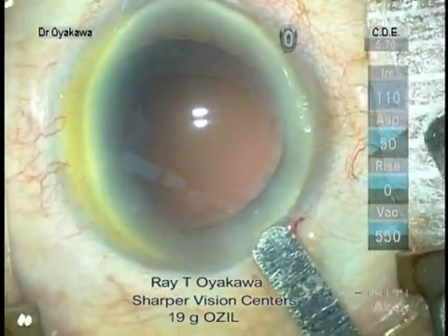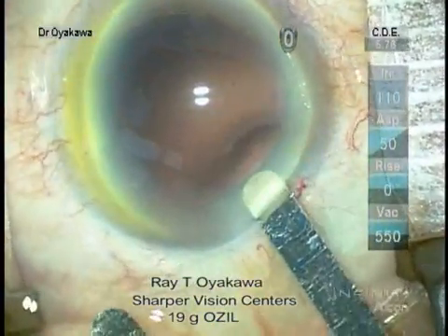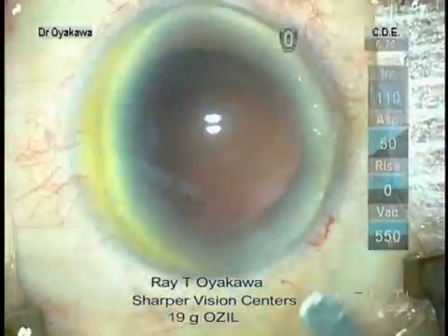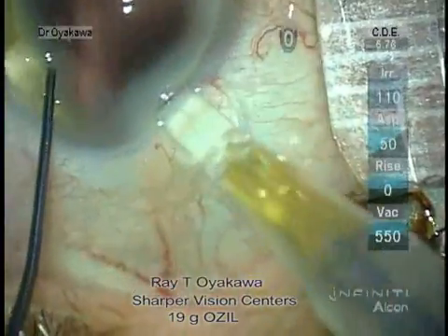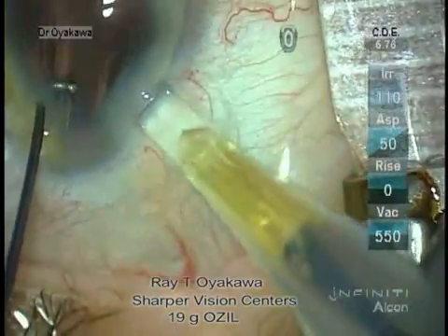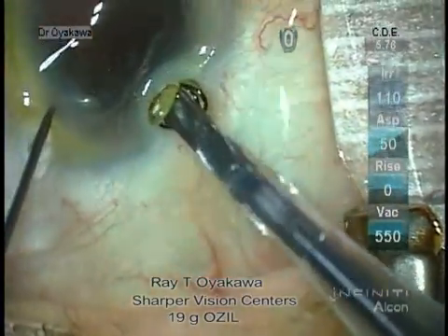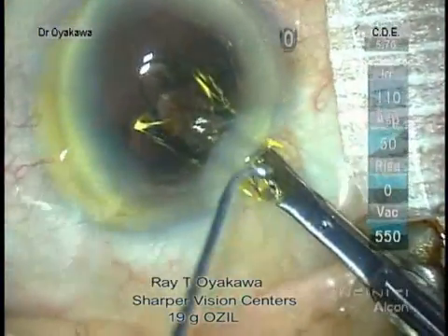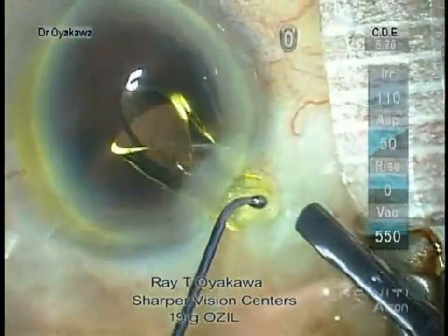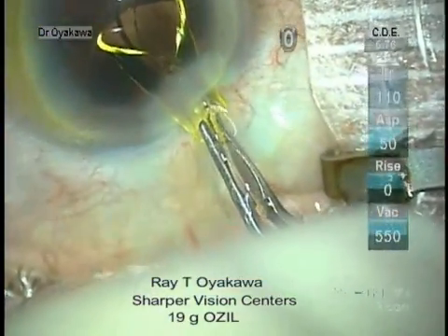Again, we use a 1.9 keratome. This case didn't go all the way in. Again, the mistake was letting the cartridge pull out from the wound rather than maintaining constant pressure. We'll use a forcep to get it in the rest of the way.